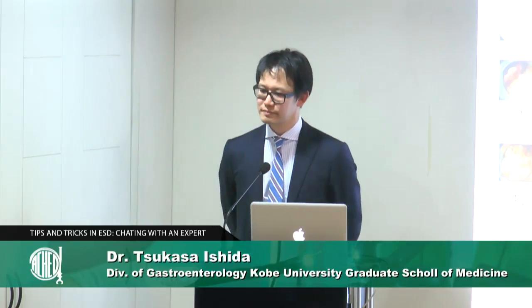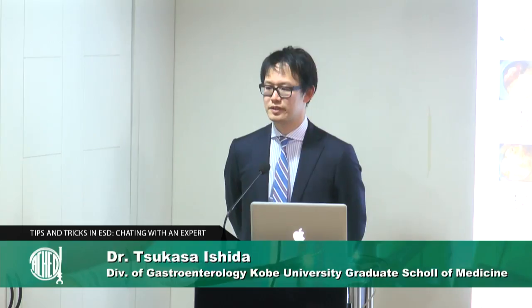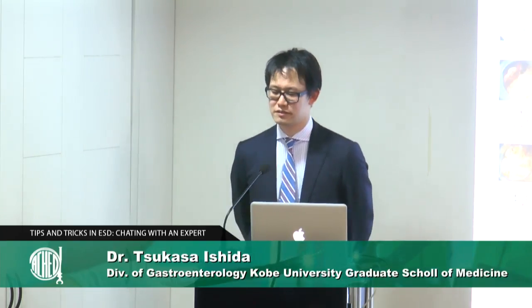Well, so interesting, because we don't have monoballoon and we don't have multi bending scope. So if we face that kind of lesion, and we have faced that kind of lesion, yes, a pediatric colonoscope would be the final option. Oh, okay. Yes. Thank you very much.